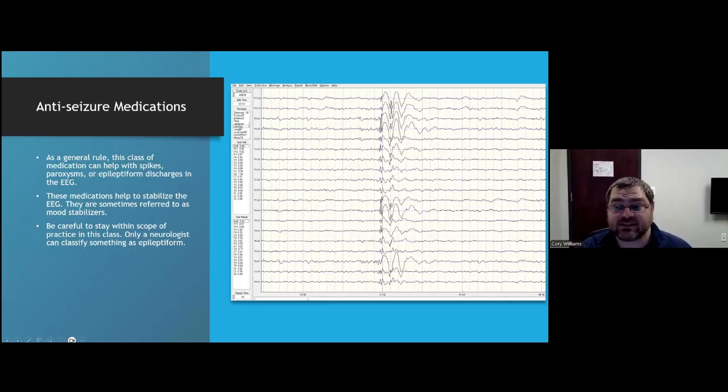So what do we do when we see this? Well, if you're looking at raw EEG, you're going to see this. If you're looking at maps, you're just going to see a head that has some theta or delta in it. But if you're looking at raw EEG, you will see this. It occurs, depending on the study you read, in about 10 to 15% of the population. Just across the board, everybody gets it.